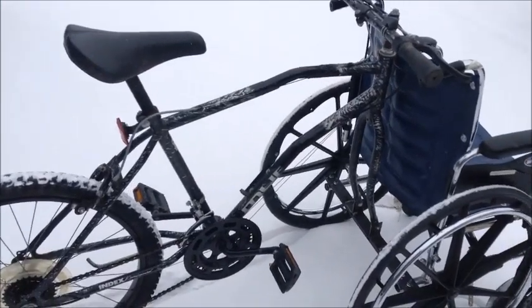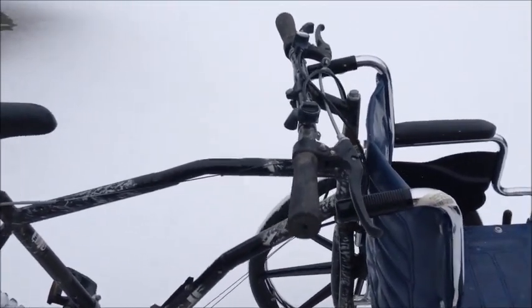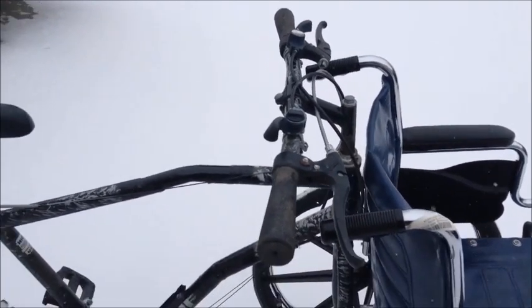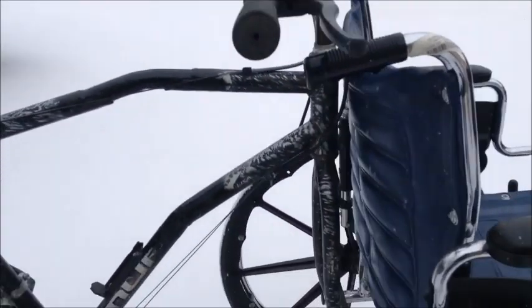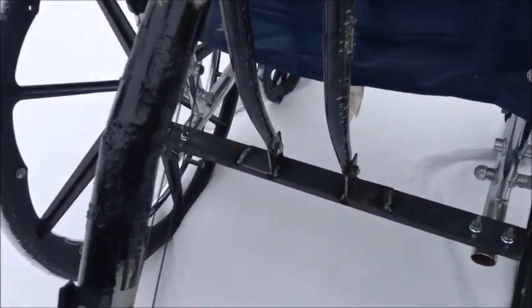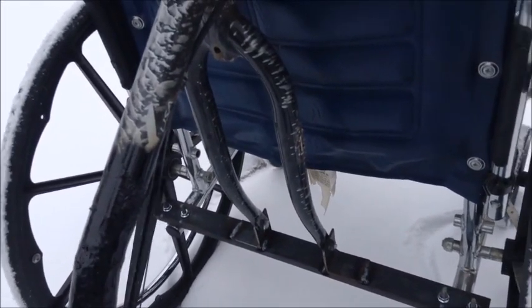Okay, here's the end product. There's the things you want to note. You see I swiveled the headstock, or the gooseneck, around so that the handlebars aren't hitting the back of anyone's head. Notice the notch, or the kink in the backbone, so the headstock can be straight up and down. Those are the tricks. That's the key. And down there on the bottom, see the plate? Mounts right on there, holds the forks with 2 pieces of angle iron.